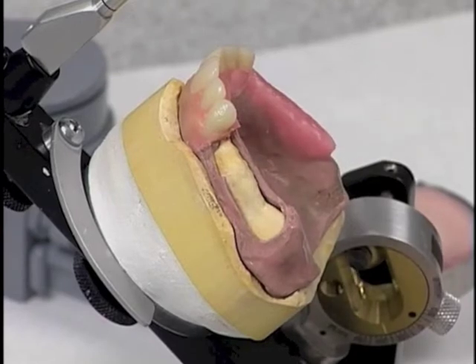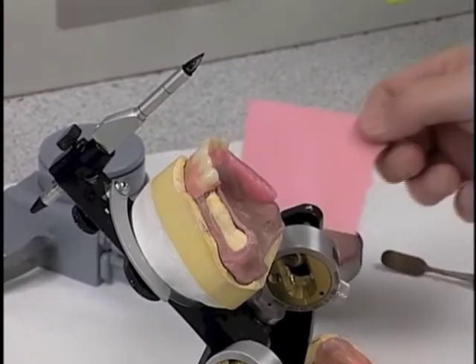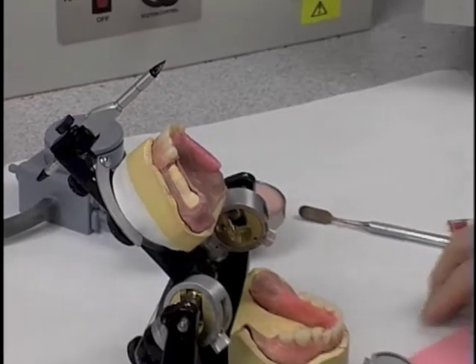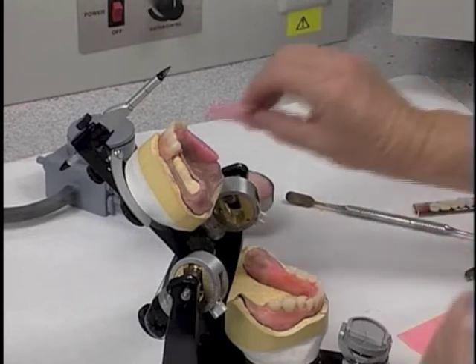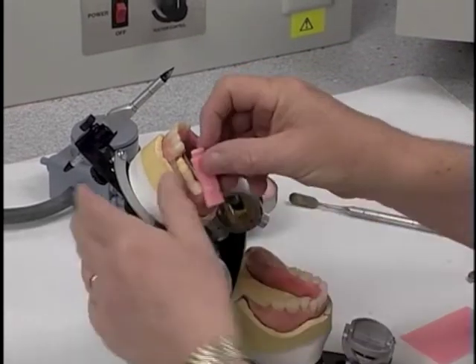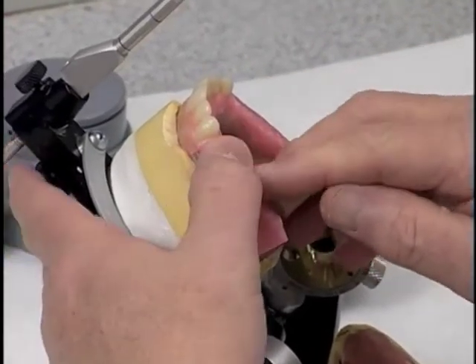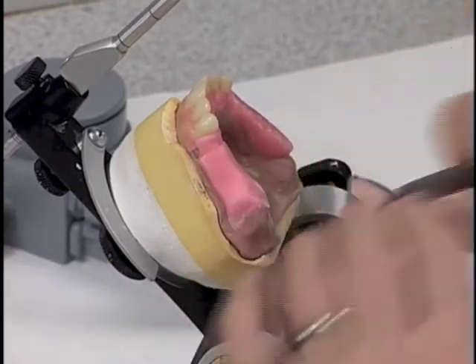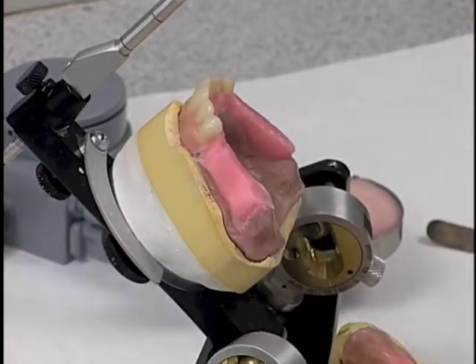Once you have the window cut, you take some base plate wax, and we're going to soften some base plate wax and just form enough wax so we're going to place it down into where we cut that window and just replace the wax that was removed before we had to go do the window. And so we're just going to mash that in place like so. We can take a knife and get rid of excess wax. And now we're ready to arrange teeth again.